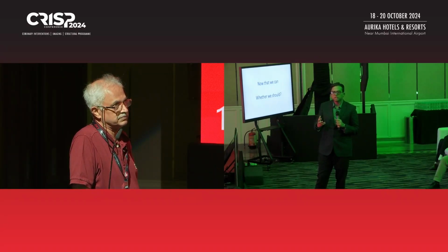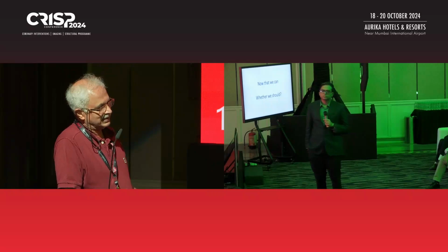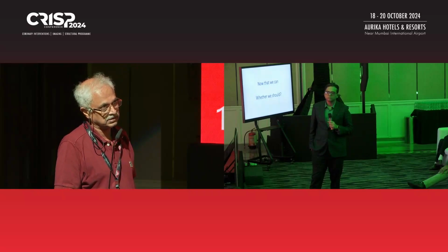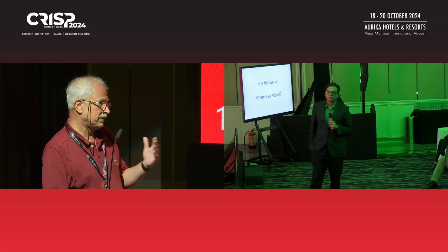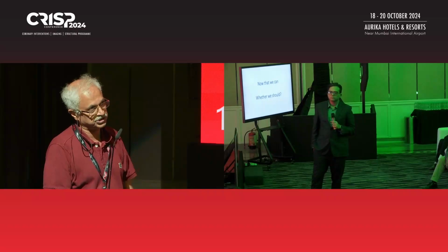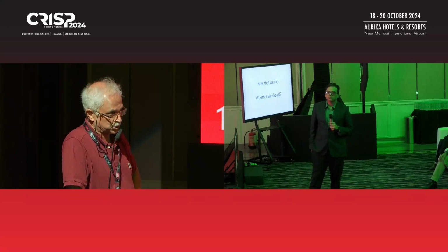So what are the other scenarios where you would not do it? One of the things that I would be really wary of is deficiency of the rims. The second one is if there is a very significant malalignment, that really scares me. Also, patients who have multiple ASDs with a history of paradoxical embolism, where I want to practically close each and every ASD. And of course, some of the cases of large ASDs in small children.